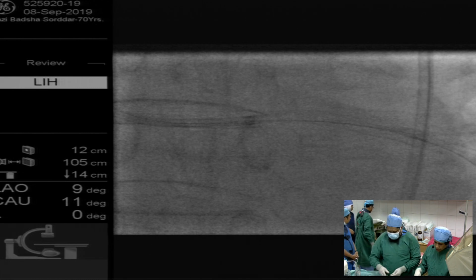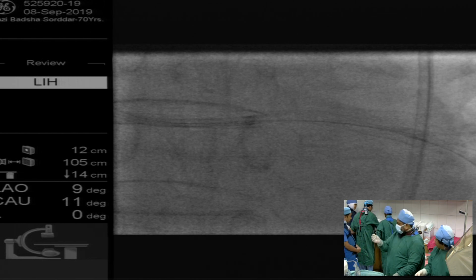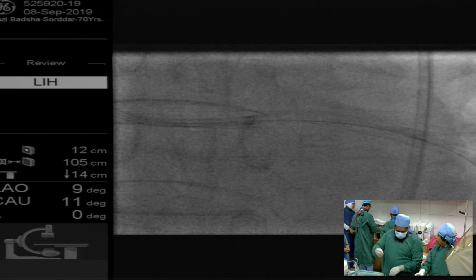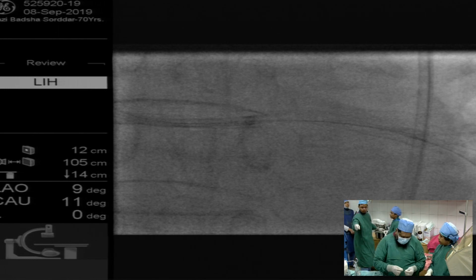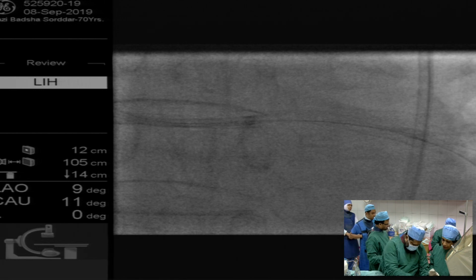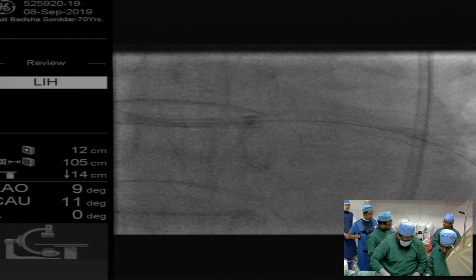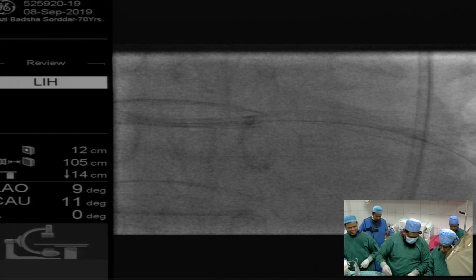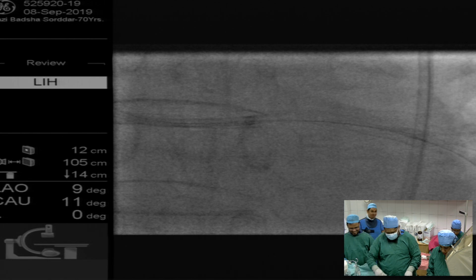Okay, so now we're going to again go through. So we're going in, Moshe. So the Dragonfly, that's what it's called, right? It's more delicate than a dragonfly. You really have to be so gentle with it. And we put it in. Why did they call it a dragonfly? They could have called it a firefly because it's got lights on. So it's in.